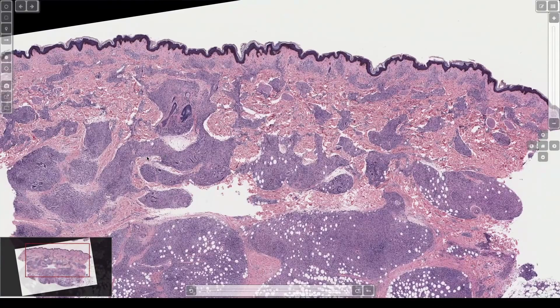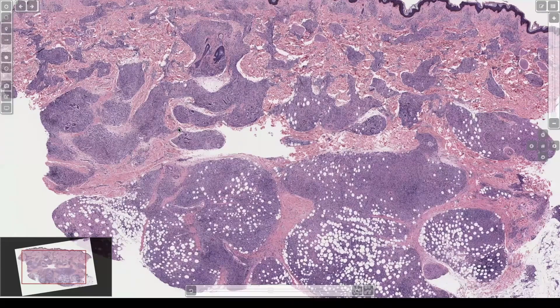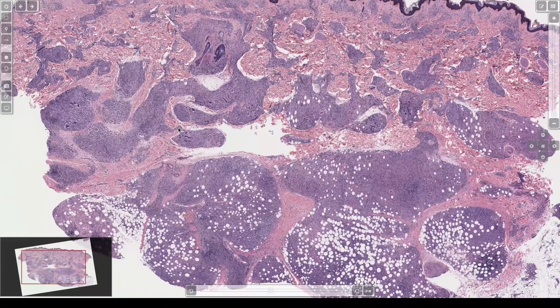We run this stain all the time but only rarely find organisms in a small subset of cases — but you do it because you don't want to miss it. The more important thing about classifying leprosy: on the lepromatous end, you have sheets of frothy histiocytes and numerous organisms.